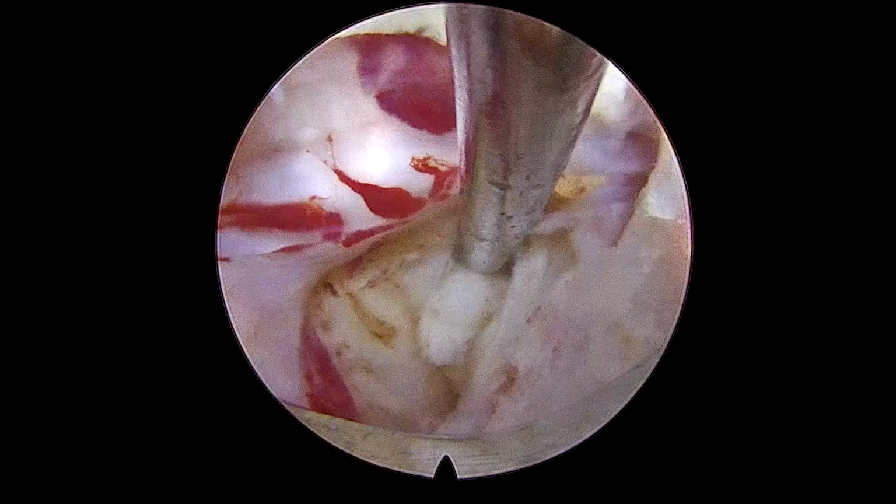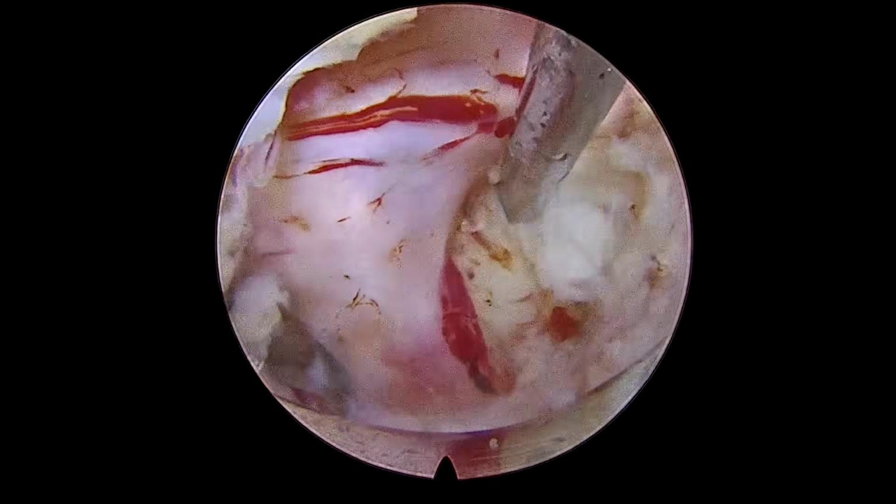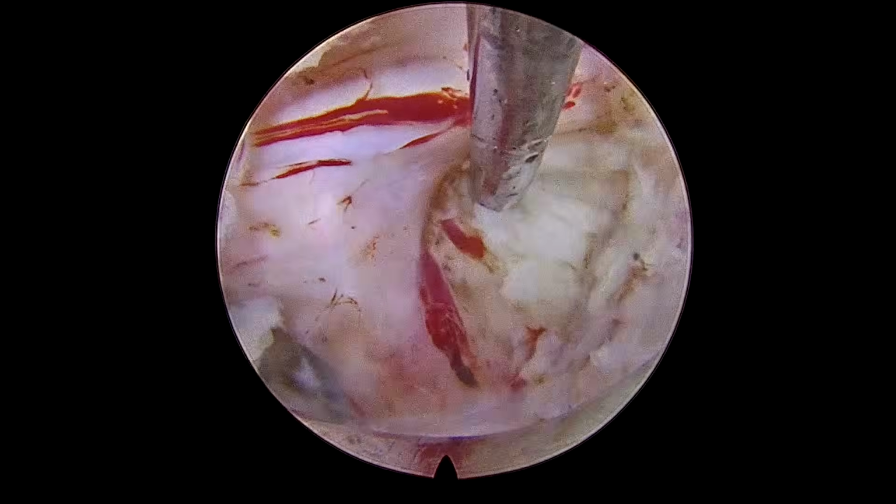So we are using a hook here. We'll just loosen all the fragments.